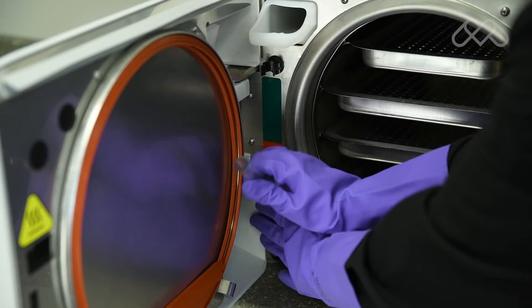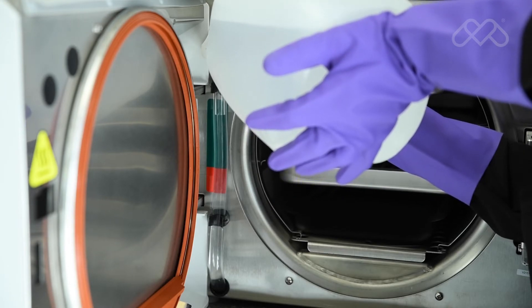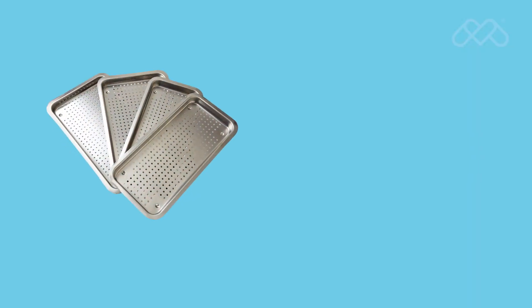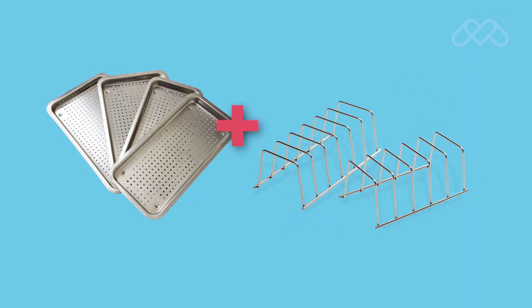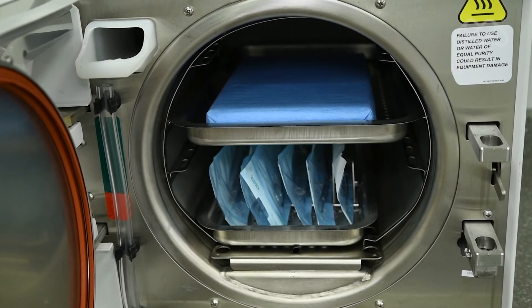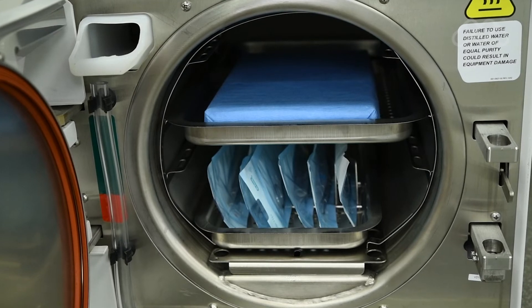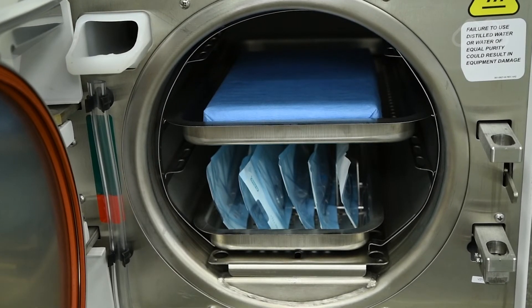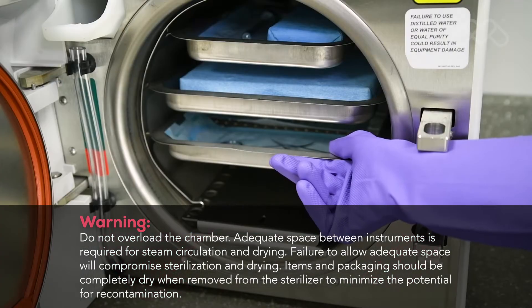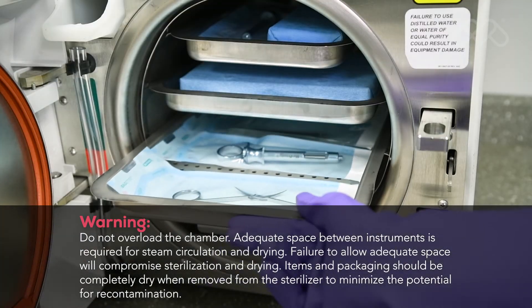Each day, the water reservoir should be drained and refilled with distilled water that meets the water quality standards for Midmark sterilizers. Use only M9 and M11 trays and racks in their appropriate sterilizer, as using other trays or racks could restrict air and steam flow, resulting in inadequate sterilization and drying. All items must fit within the tray and not extend over the lip of the sterilizer tray.